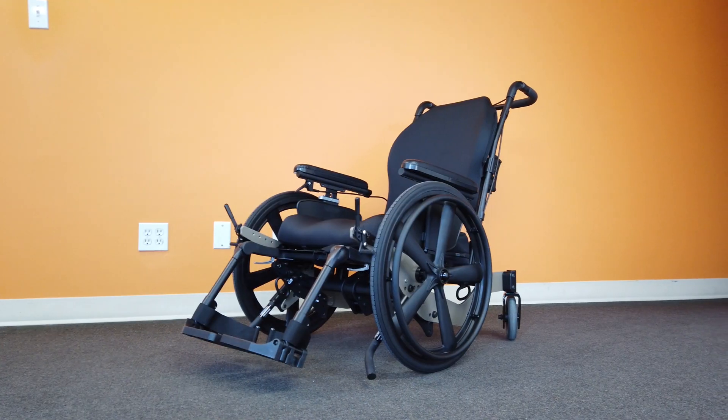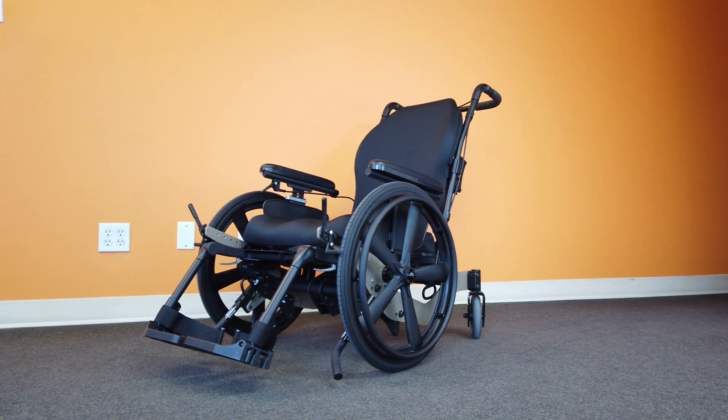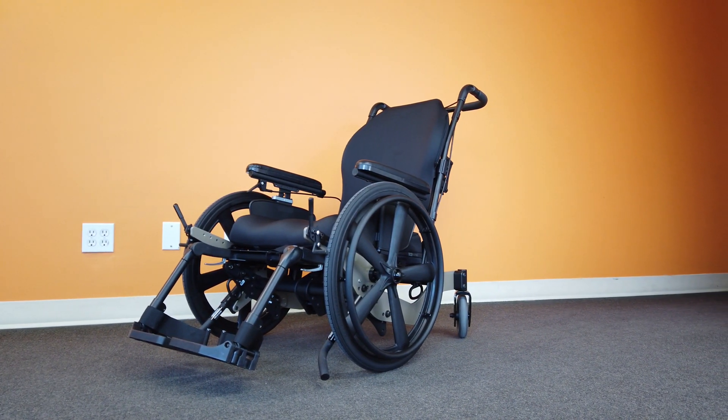At 12 inches, the Bentley LTR also boasts the lowest seat-to-floor height available at PDG Mobility, allowing the user to keep their feet on the ground even when the chair is tilted.